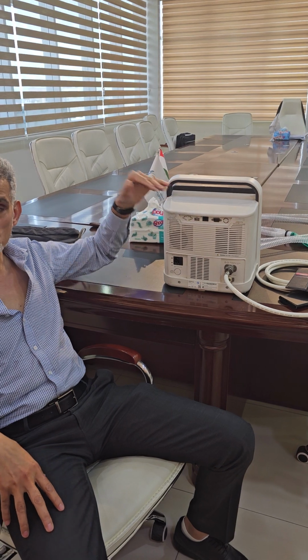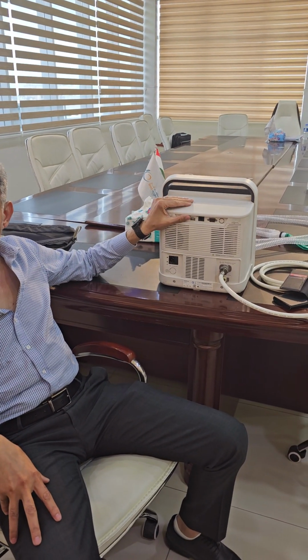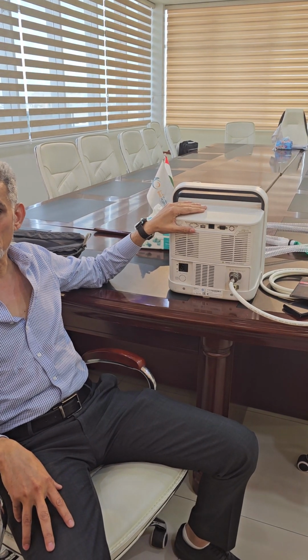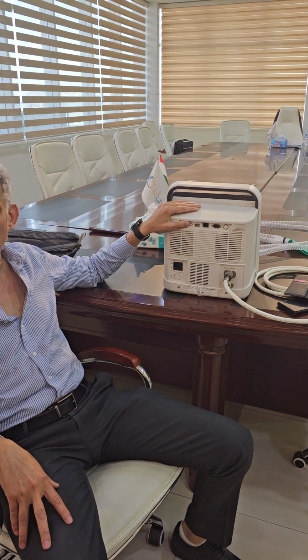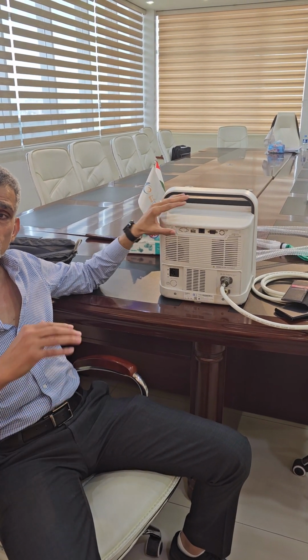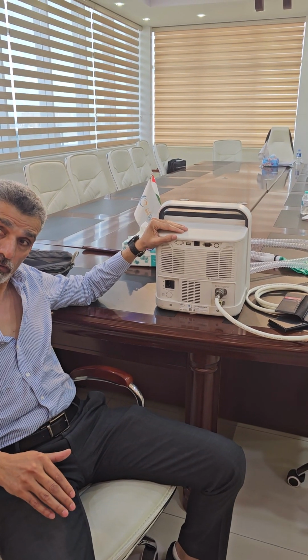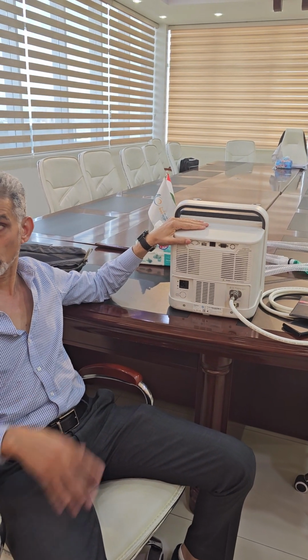So the pressure is either generated somewhere in the hospital and then comes through tubing to the ventilator, or the ventilator should have a compressor. Now for a long time it's not acceptable at all to use a compressor with a ventilator, because it looks like you have a fridge and you're sleeping on the fridge. Imagine there is a fridge working and you sleep on it, and it becomes right at your ear doing like this when it works. I will show you.